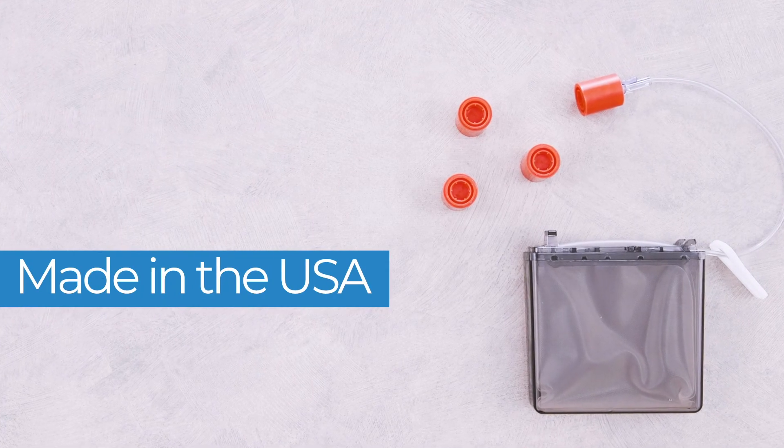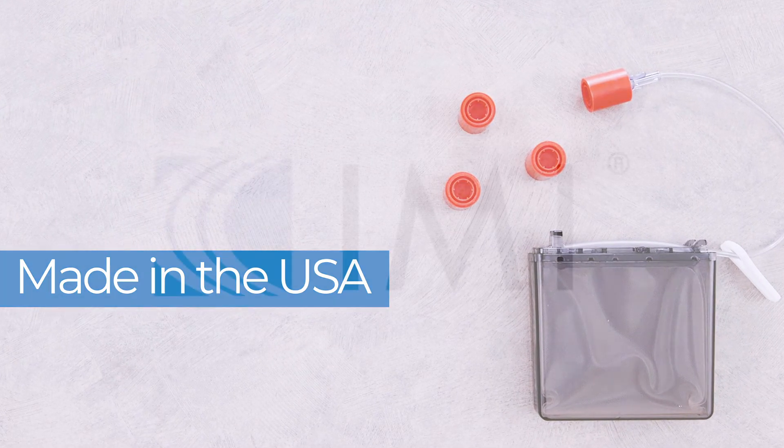PrepLock Tamper Evident Caps make a clear statement about how seriously your facility takes drug safety.